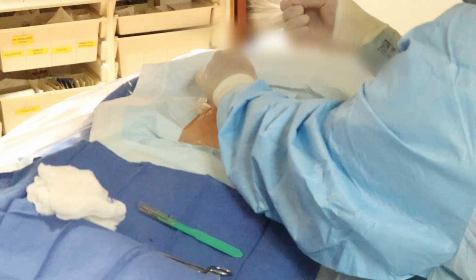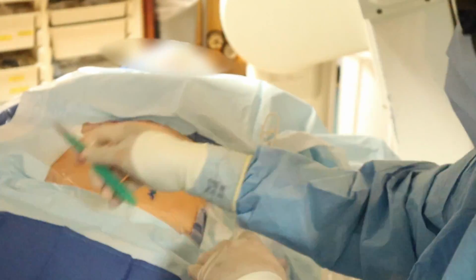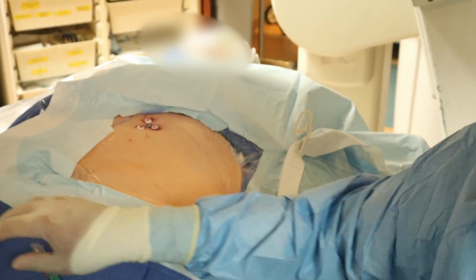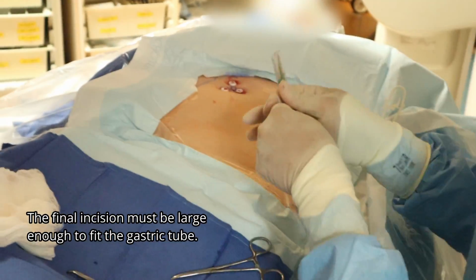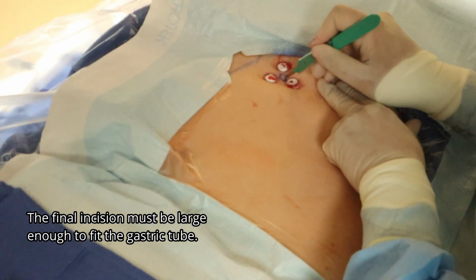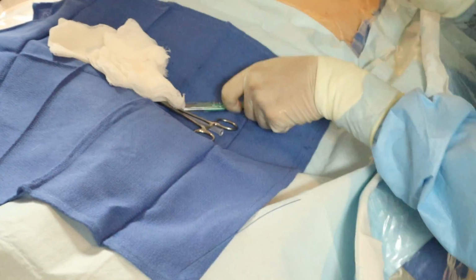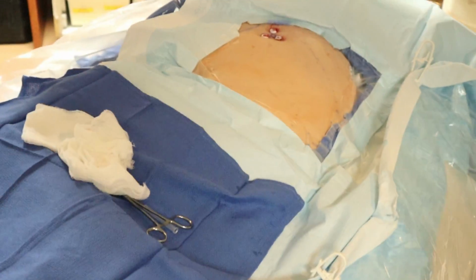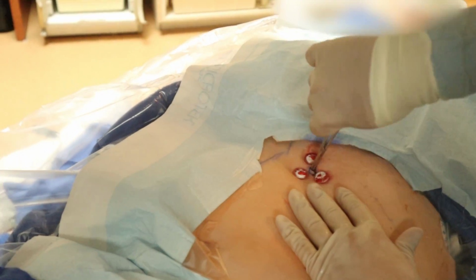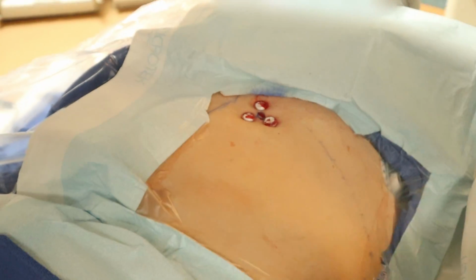So the difficult part of the procedure is now complete. We just have to make a large enough hole to introduce our G-tube into the stomach. So I'm going to make about a centimeter horizontal incision over this entry site. Adequate soft tissue dissection is very important. Make sure that nothing gets hung up on the soft tissues. Be very liberal with the soft tissue dissection.